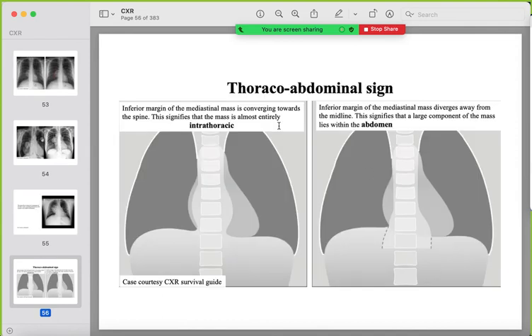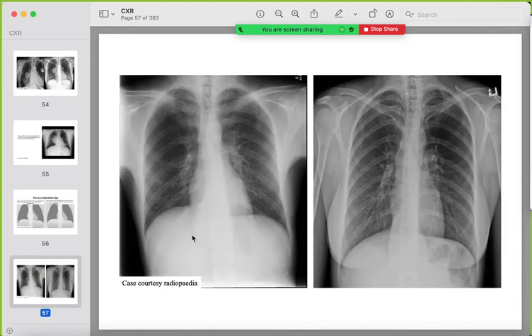The thoracoabdominal sign occurs when a posterior mediastinal mass disturbs the paraspinal lines on each side of the vertebrae. It can extend into the abdomen or remain intrathoracic. The differential is wide: extramedullary hematopoiesis, paraspinal abscesses, or hematoma from trauma and fractures.